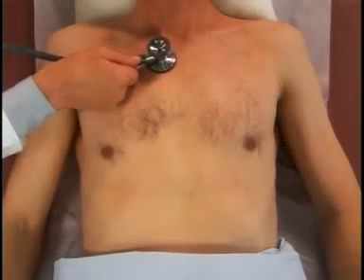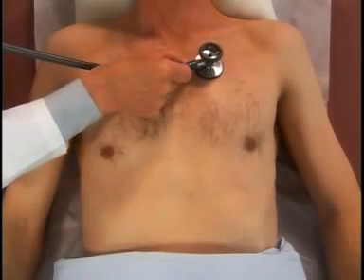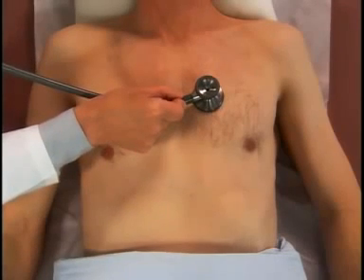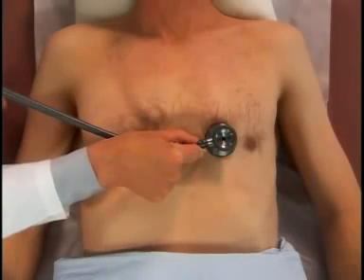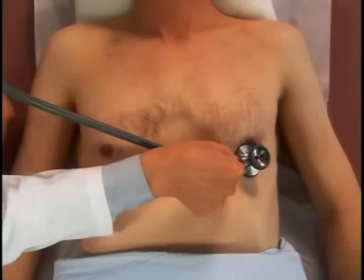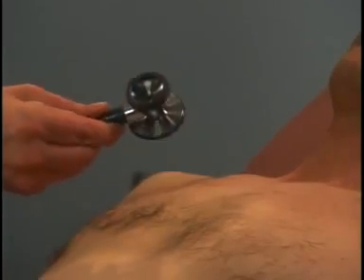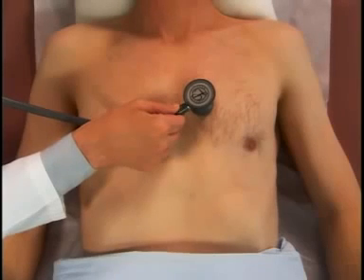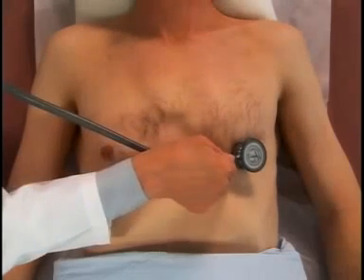The auscultation sequence will start with the diaphragm of the stethoscope and progress from the base of the heart, moving from the right second interspace to the left second interspace and down the left sternal border to the apex. Then, with the bell of the stethoscope, we will listen along the lower left sternal border in the left fourth and fifth interspaces. Then we will listen at the apex.